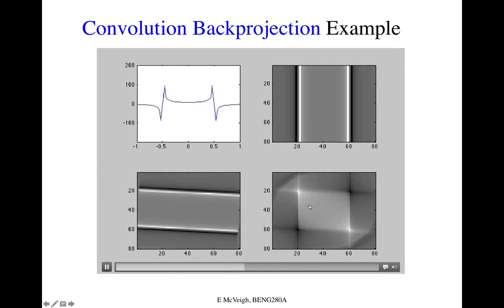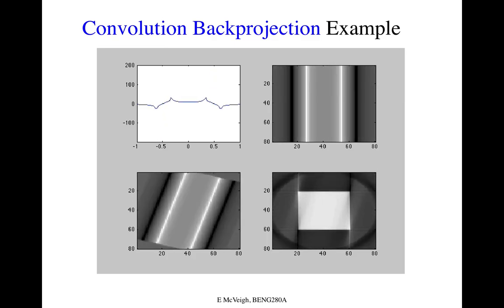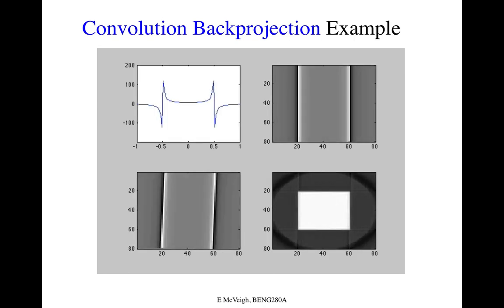It's interesting to watch the evolution of the object. As it passes through vertical and horizontal edges, the edges just sort of snap into focus. And so they're very critical points in the sampling of certain objects. It makes CT an interesting imaging modality for trying to image motion, because it's very sensitive to what direction it's in. Imaging really sharp discrete objects, it's obviously very sensitive to grabbing the edge of a discrete object.